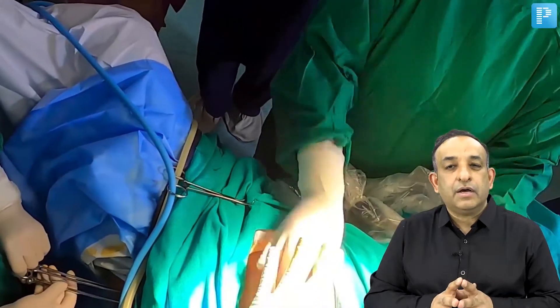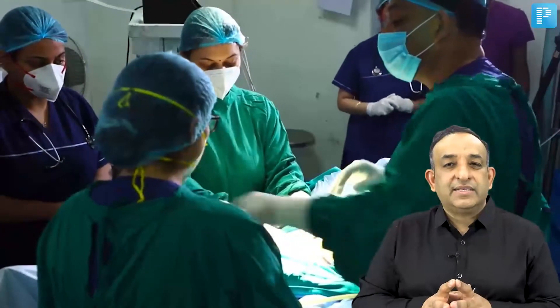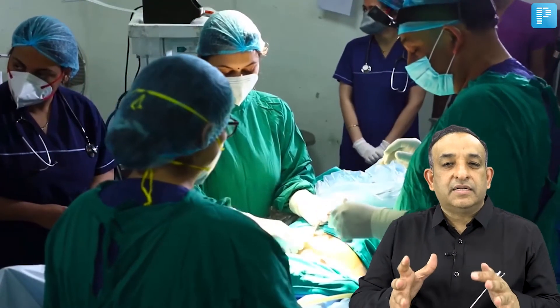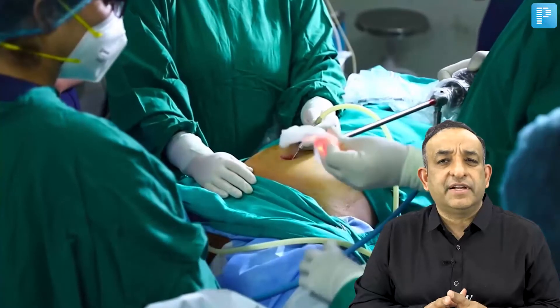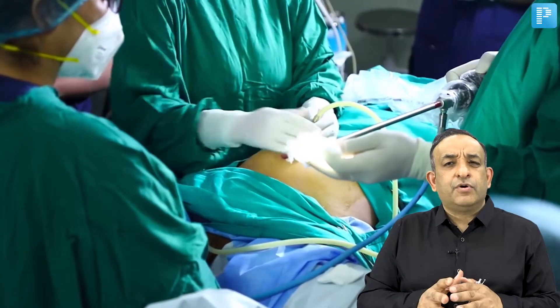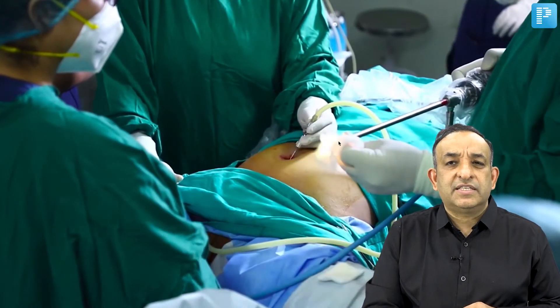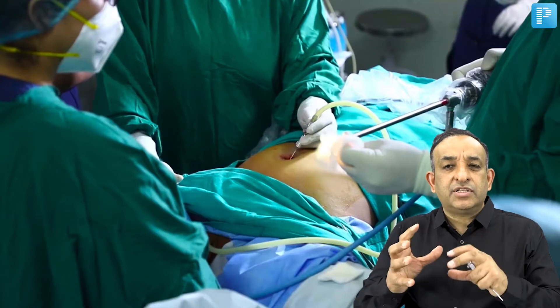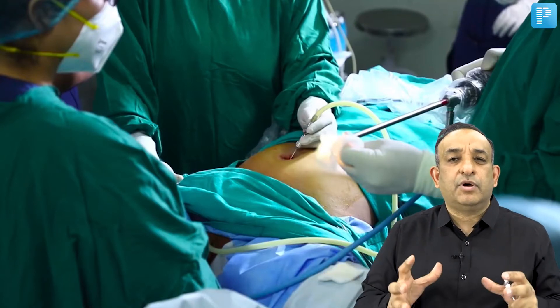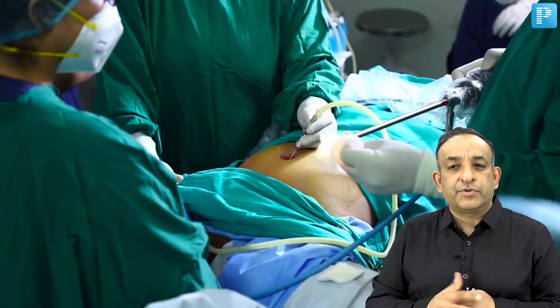Once inside the abdomen, we start insufflating carbon dioxide to distend the abdomen with 2.5 to 3 liters. We can assess distension by tapping the abdomen — there will be loss of liver dullness and tympanic sounds. At the same time, I am doing a white balance on the scope using a white gauze piece, to ensure whatever I see in the abdomen is on a proper white background.